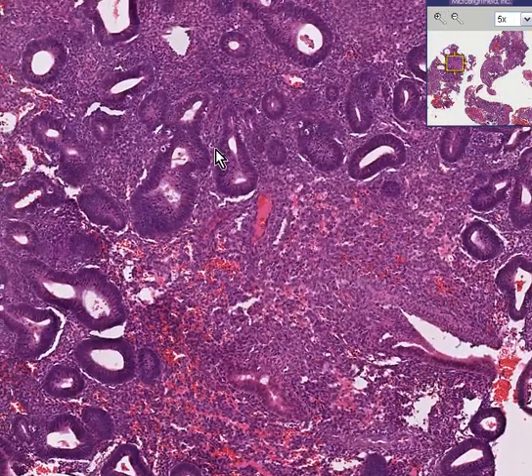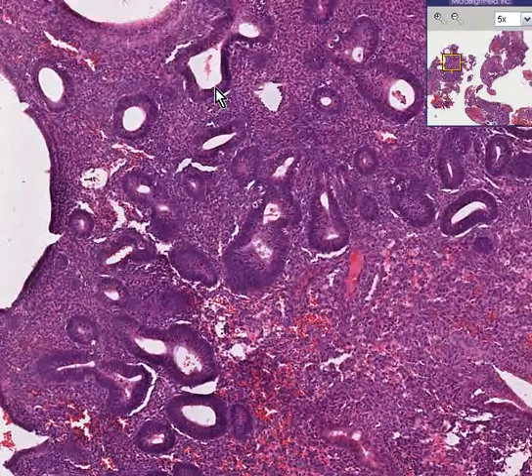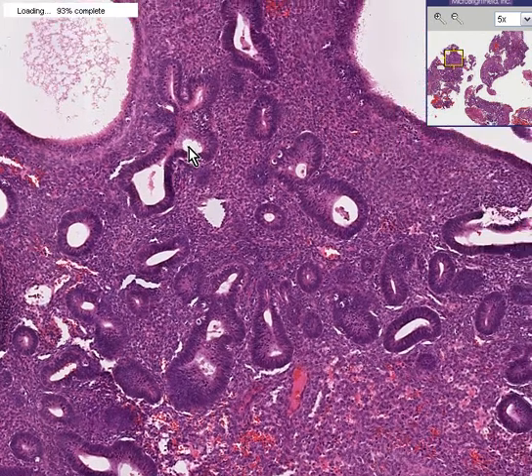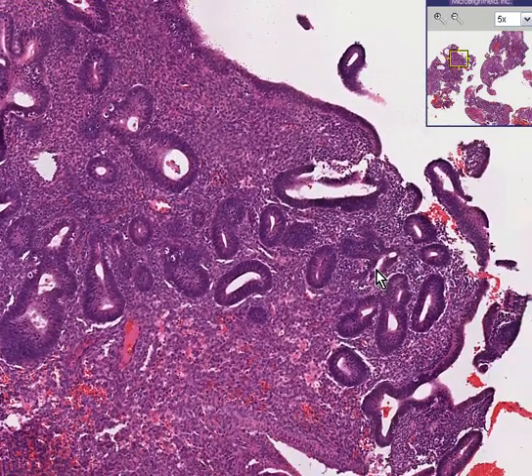And not only are there a lot of glands, but some of them are a little bit closer to each other than they should be. There is a predominance of glands relative to stroma. This is called hyperplasia, which is defined anywhere as increased in number of cells. Hyperplasia of the endometrium is due chiefly to increased levels of the hormone estrogen.